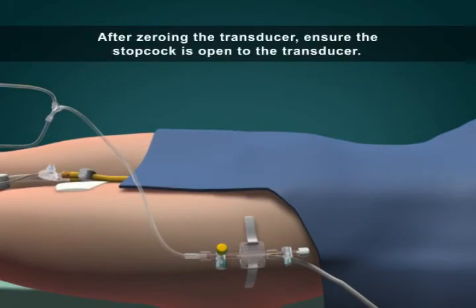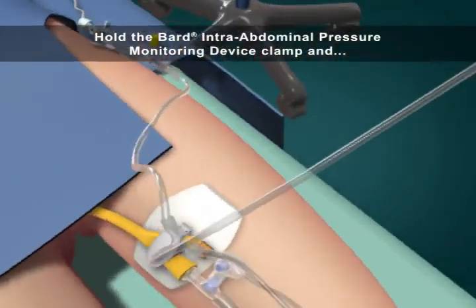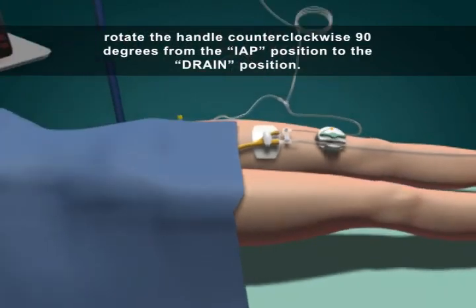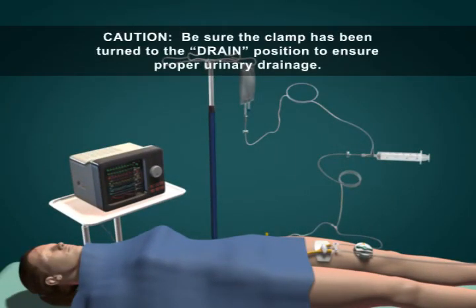After zeroing the transducer, ensure the stopcock is open to the transducer. Hold the Bard intra-abdominal pressure monitoring device clamp and rotate the handle counter-clockwise 90 degrees from the IAP position to the drain position. Caution: be sure the clamp has been turned to the drain position to ensure proper urinary drainage.